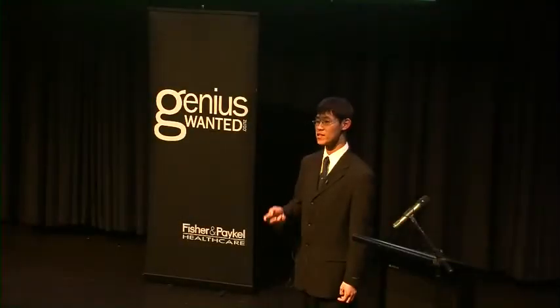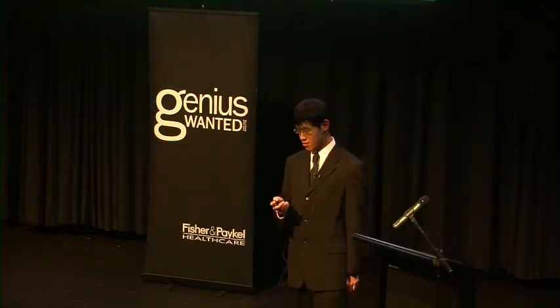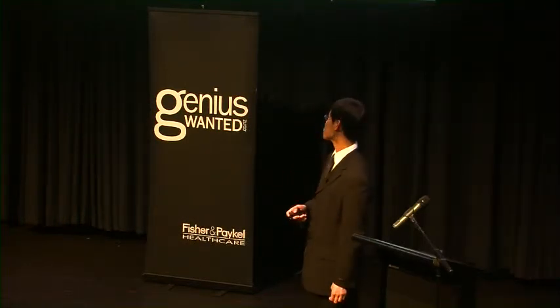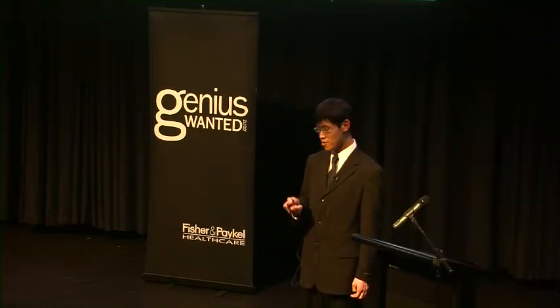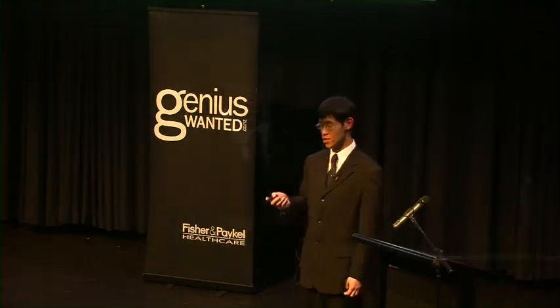In order to correct for background phase, we need to know the background phase image. Because if we know the background phase image, then we can just simply subtract it out and that gives you the true velocity image. However, the problem is, in all cases, we don't actually know what this is. So my research is about answering the question, well, given any image or scan sequence, what is the background phase?